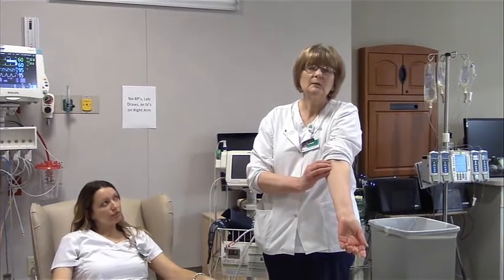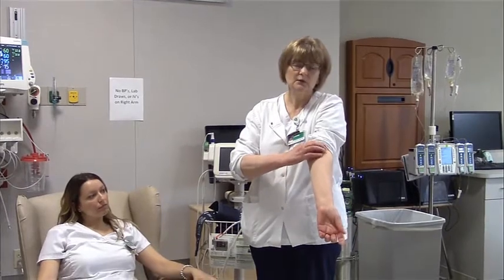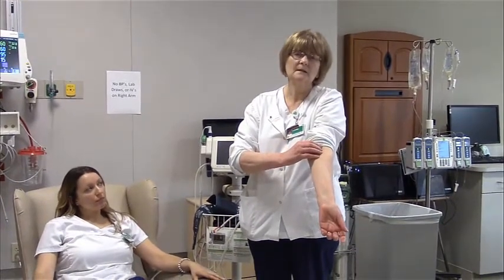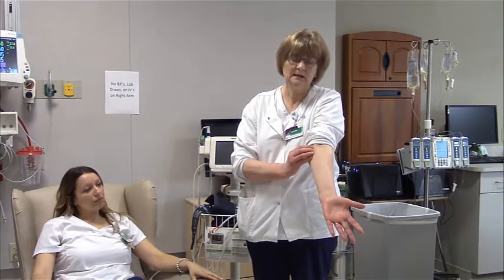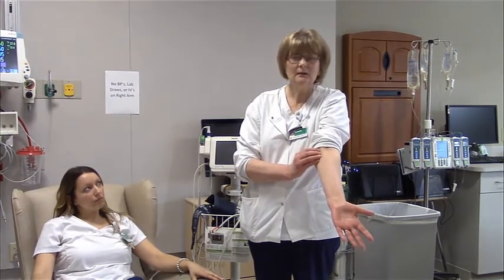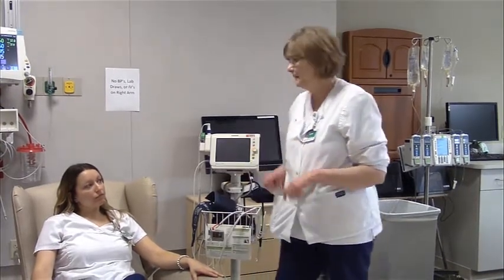You should be able to pick up a brachial pulse. So many times I've seen people try to get that pulse from the center. You won't find it there. It's always living on the outer edge, the pinky side. I do need to know where that locates because my blood pressure cuff is going to be going there. Okay? And we're going to come back shortly to that one.